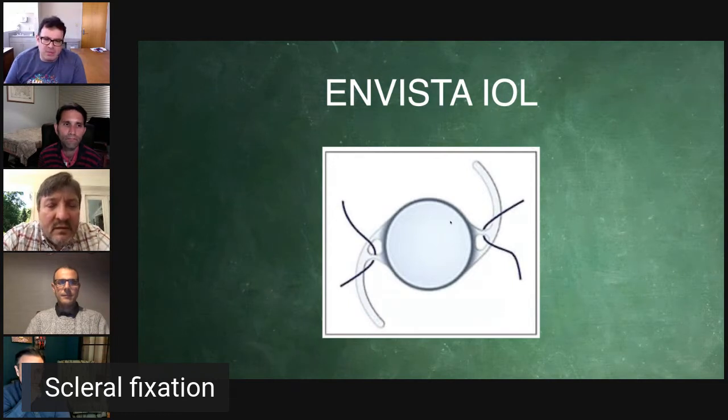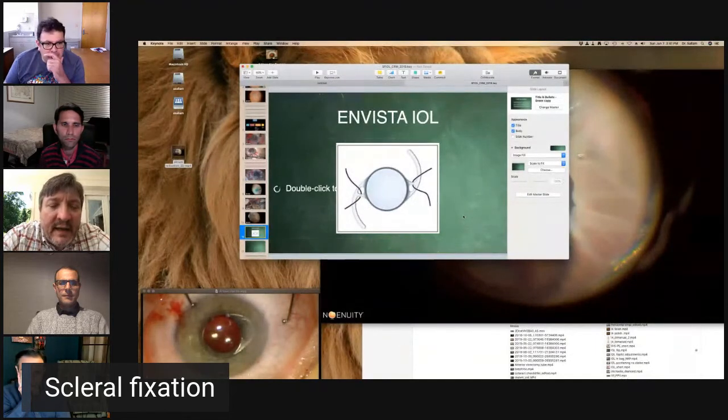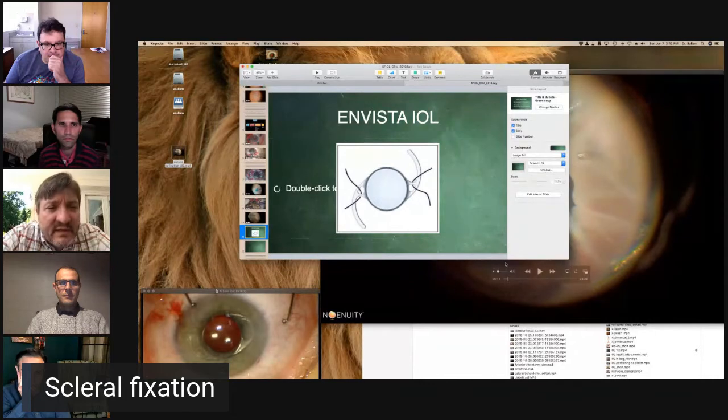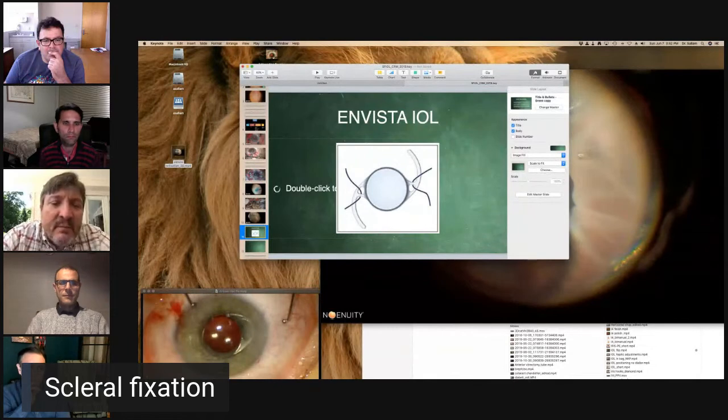You come out to 4 point, but the lens as well is held by just 2 point, really, 1 point on each side going through the loop. So I don't know, what do you feel? I've got several colleagues that swear by this lens. They love it. I agree with you. I think it's 2 point fixation if you use it the way it's illustrated here.